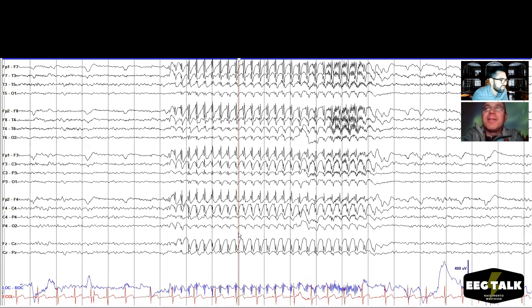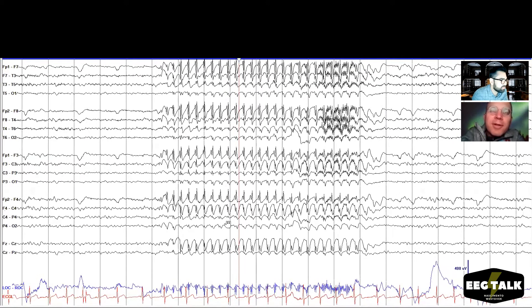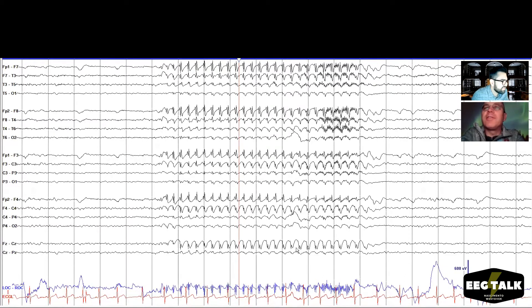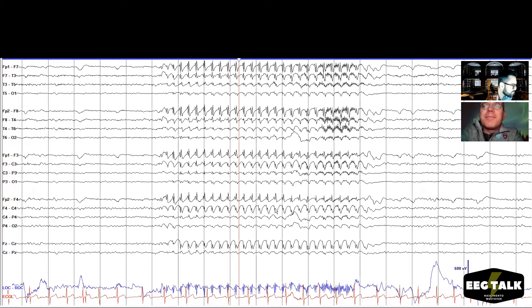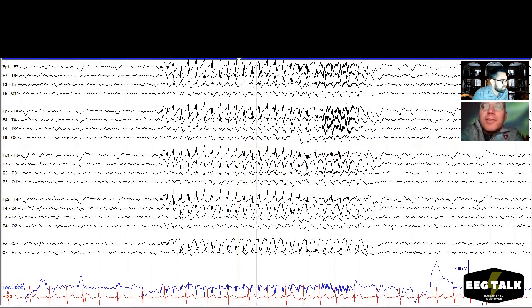I can't remember what this is — you'll have to explain it because of my head injury. It's pretty different from everything we've seen so far. They're just blinking really fast, rhythmically — that's a good differential. But I think you forgot that it's more in the front, that's a good point. And what about these little spikes before these slow waves? Those look like spike-and-wave complexes.